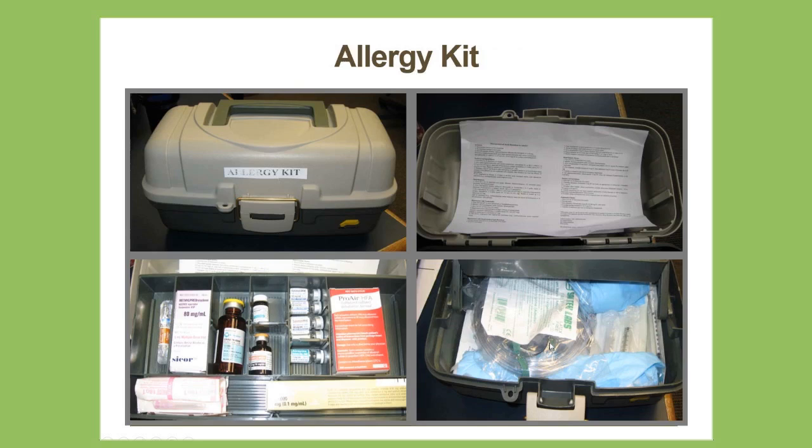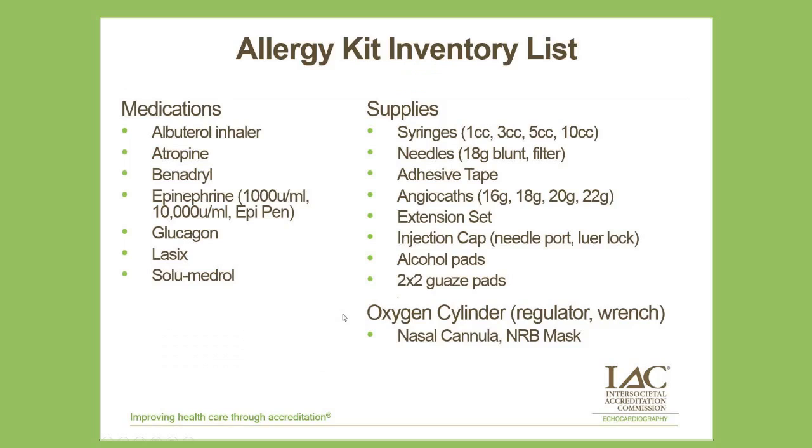So what can we do to mitigate this risk? Well, at our center, we've provided allergy kits in close proximity to imaging platforms, just a commercially available tackle kit stocked with drugs that would be necessary to treat allergic reactions in the acute phase, the most important component of which is the auto-injectable epinephrine pen, or EpiPen, which is necessary in cases of extreme allergic reaction, including patients with vascular collapse.